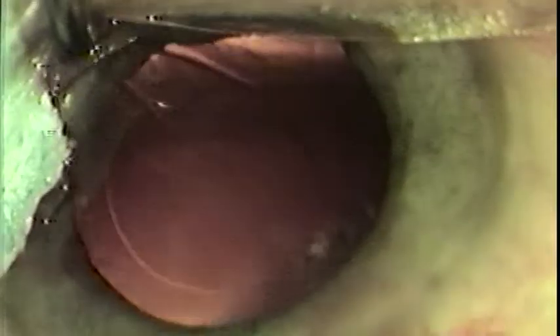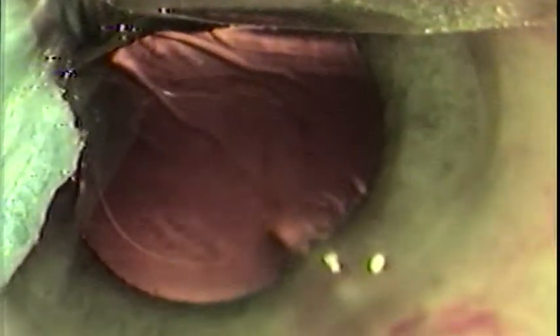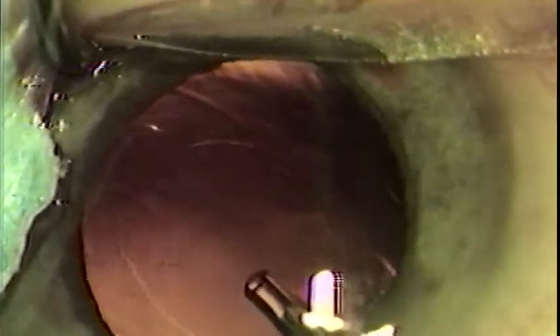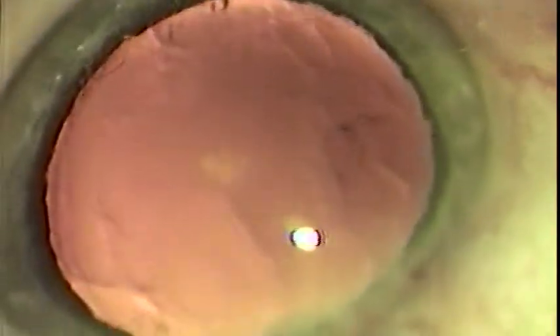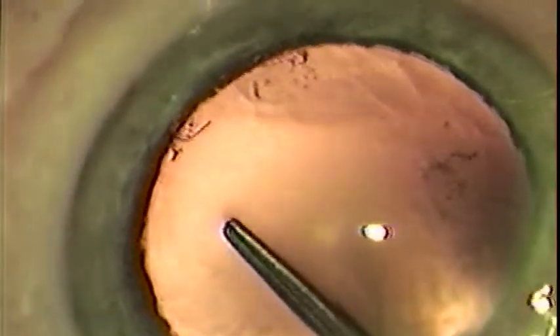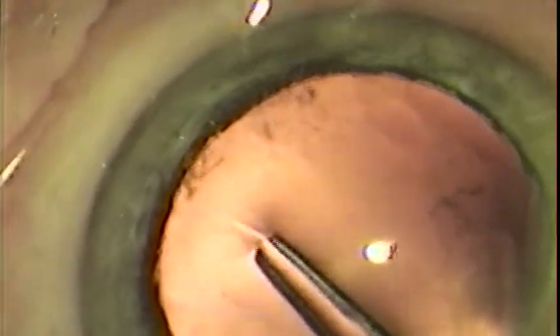Here I show the capsule immediately after intercapsular phacoemulsification, inflating the capsular bag with Helon GV, showing what a smooth-edged continuous capsulorhexis enables you to do. With a little practice, reproducible round central capsulorhexis are possible with very little effort using the new one-step capsulorhexis cystotome forceps.